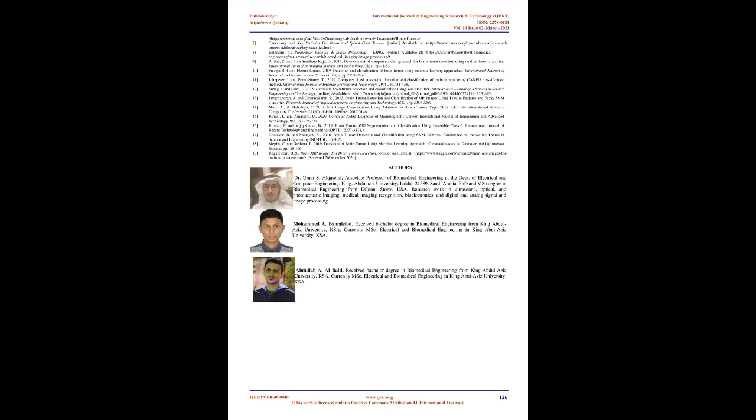2 main classifiers were used for classification. Support Vector Machine classifiers, SVM-RBF, SVM Polynomial, SVM Gaussian, and SVM Linear, and K-Nearest Neighbors classifiers, KNN1, KNN2, KNN3, KNN4, KNN5, are the ones applied in our paper.